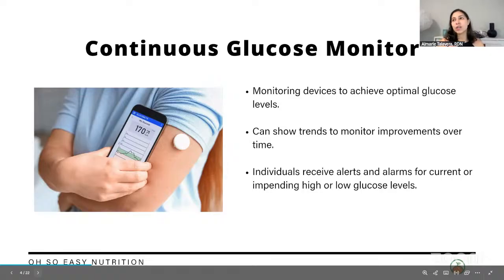We're not necessarily looking at this one-time occurrence like, oh, you had really low blood sugar in the middle of the night. What could be going on? And then you're reacting quickly, trying to make nutritional changes off of one incident. We want to actually avoid that. We want to see, is there a pattern of that going on through a series of days?